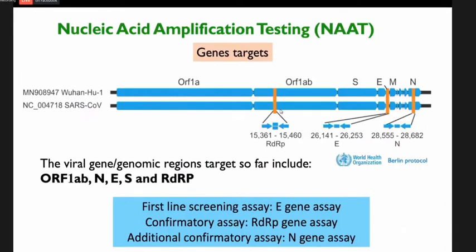The molecular assays used to diagnose SARS-CoV-2 are designed to detect specific target viral genes and regions, including the S or spike, envelope, or nucleocapsid protein or gene, which represent the 3 or 4 major structural proteins of the virus, as well as other genes that can be targeted, including the RNA-dependent RNA polymerase, RdRp gene, and the open reading frame 1a and b region.